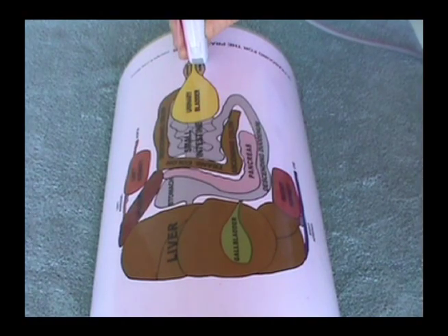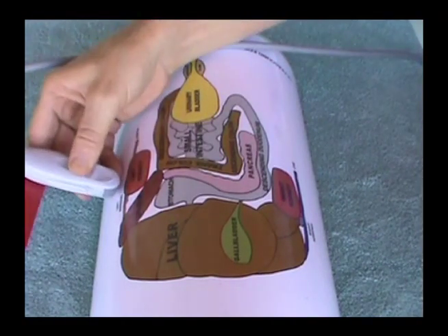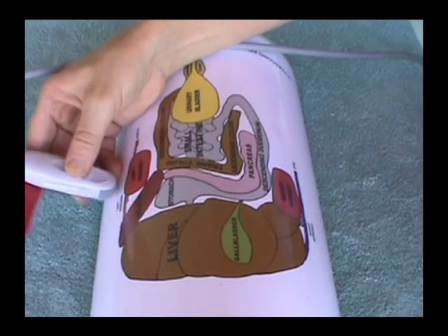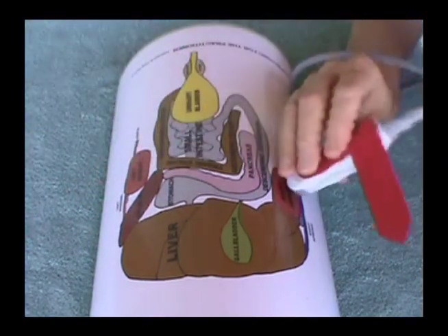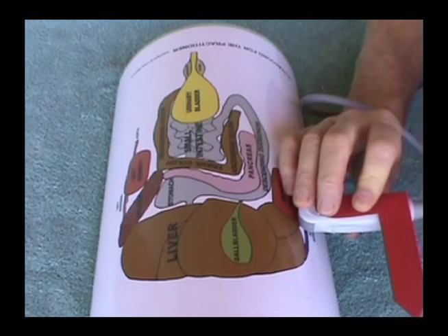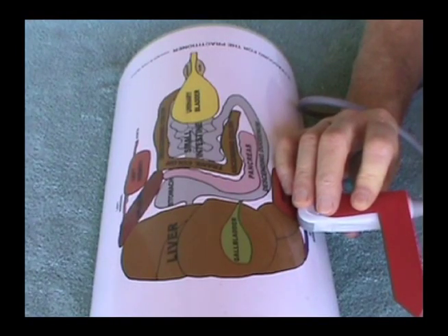Usually you will place the transducer in the left or right lateral sagittal plane to view the kidneys or adrenals.